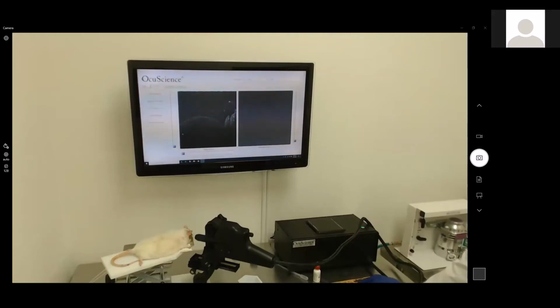Not to make this an OcuScience OCT show. That's not my intent. What I'd like to do is twist the conversation a little bit about just OCTs in general. OCT applications, each system is going to have the ability to capture cornea or posterior imagery. They may require different optics and things such as that.